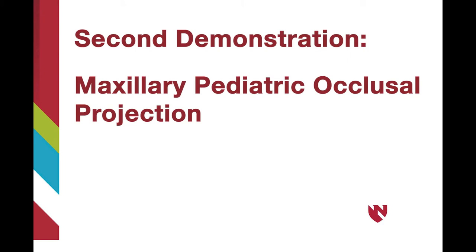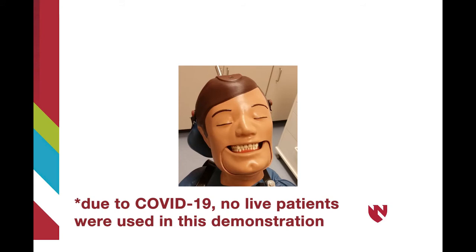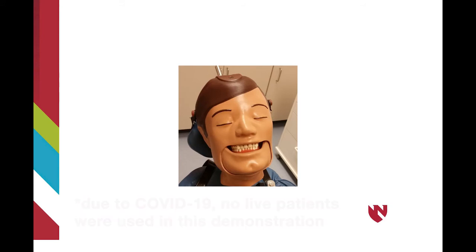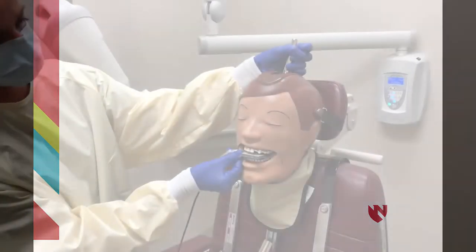The next demonstration will be of a maxillary pediatric occlusal projection, which is similar to the maxillary topographic occlusal projection. In this presentation, we will be demonstrating on an adult patient; however, we will be describing the procedure for a pediatric patient. A maxillary pediatric occlusal projection can be beneficial in the pediatric population for a variety of reasons. The occlusal film allows for the evaluation of growth and development of permanent teeth, as well as any anterior crowding, trauma, pathology, or objects located in the area.